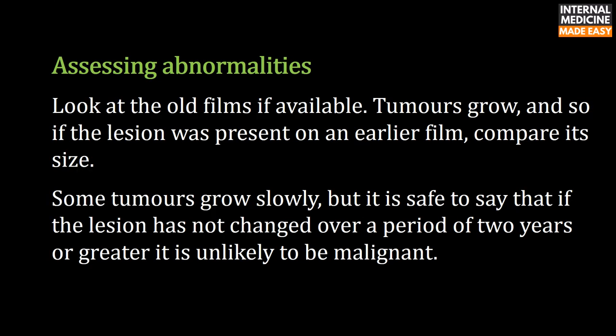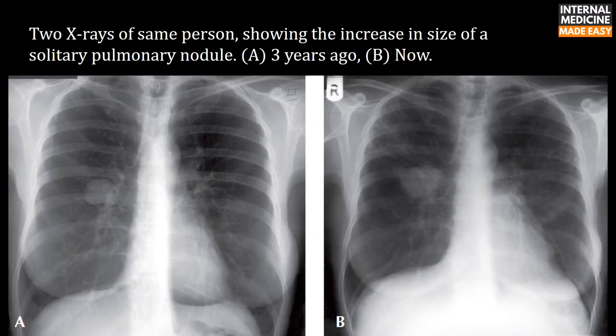Look at old films if available — tumors grow, so if the lesion was present on an earlier film, compare its size. Some tumors grow slowly, but if the lesion has not changed over a period of two years or greater, it is unlikely to be malignant. These two X-rays of the same person show an increase in size of a solitary pulmonary nodule: image A is three years ago and image B is the current film.